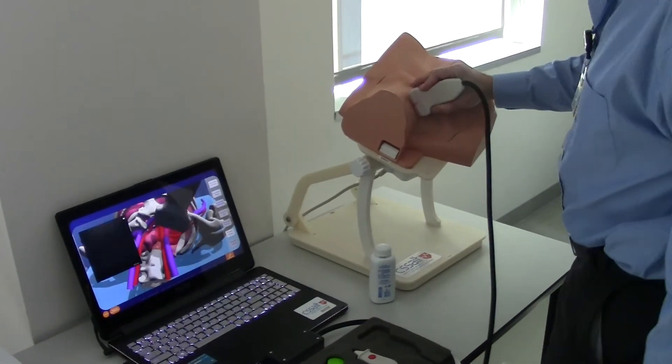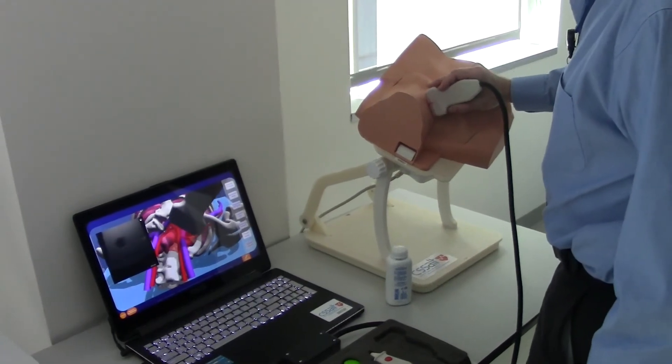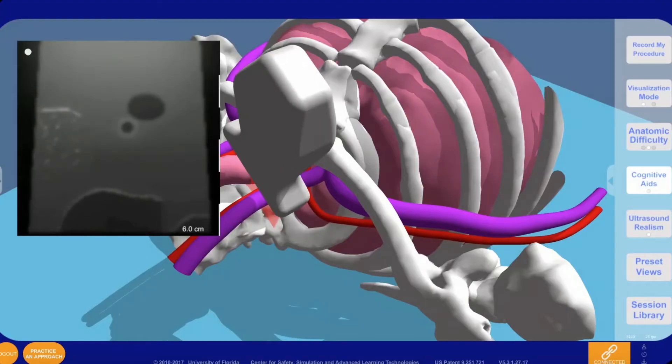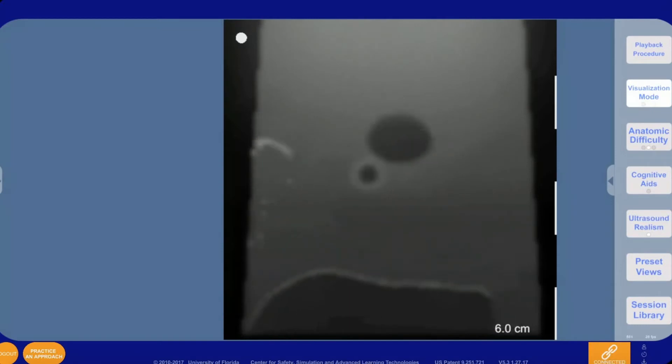The simulated ultrasound images are generated in real-time according to the position, orientation, and applied pressure of the physical probe that is tracked in space. Markers show depth in centimeter increments.